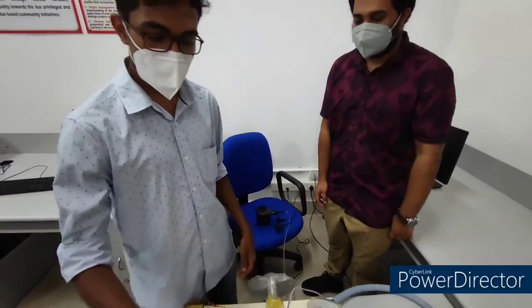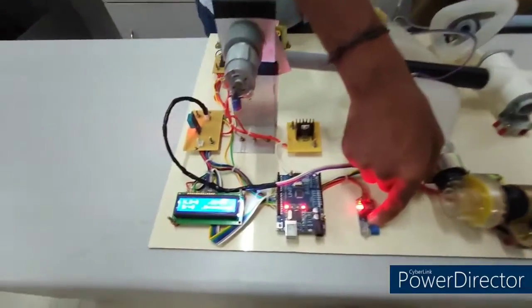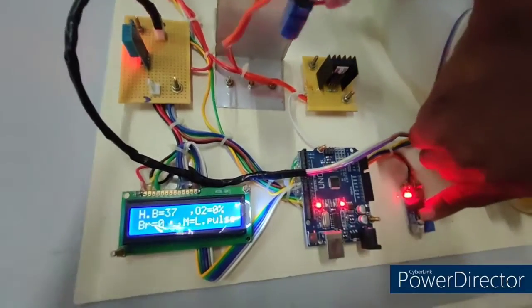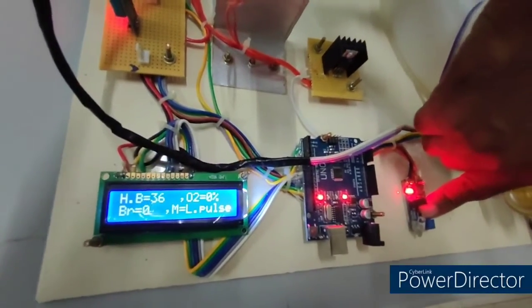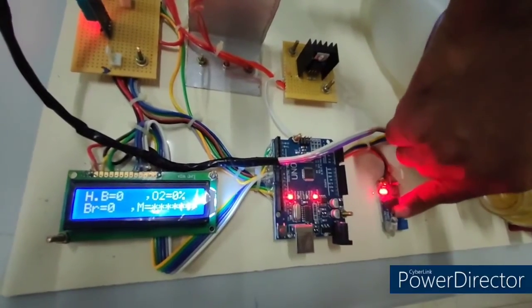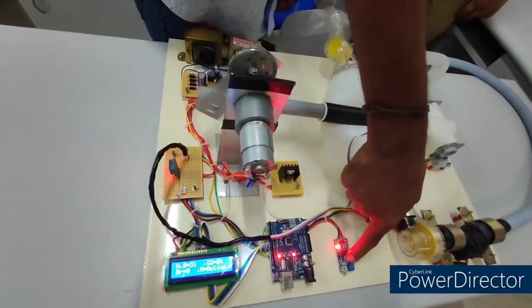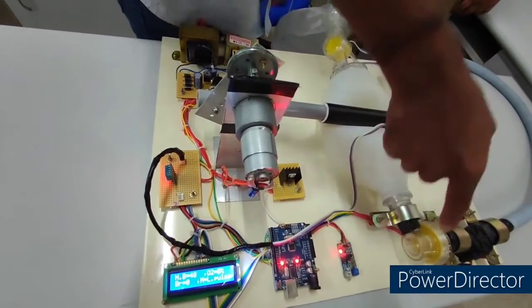This is a quick demo of our project. First, we place a finger in the pulse oximeter. The reading currently shows a low value, so the ventilator does not activate. When the pulse value becomes greater than 50, the motor will rotate at medium speed.